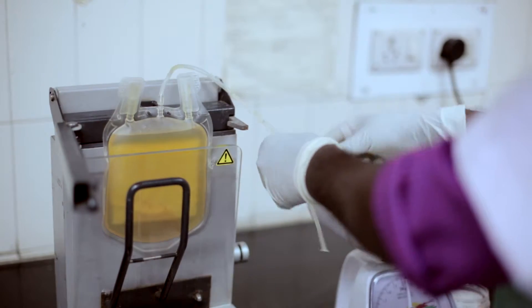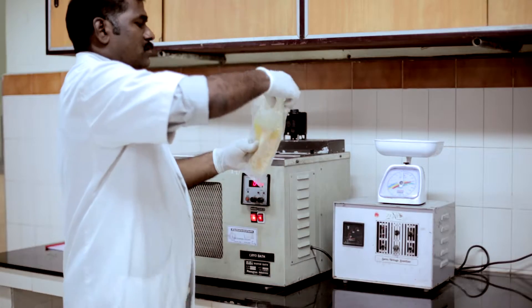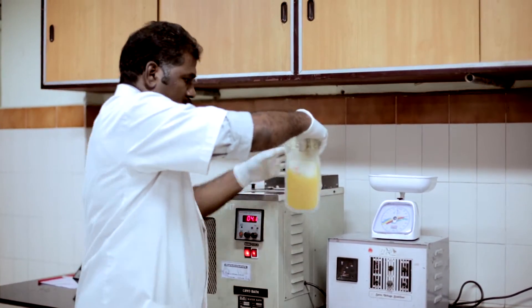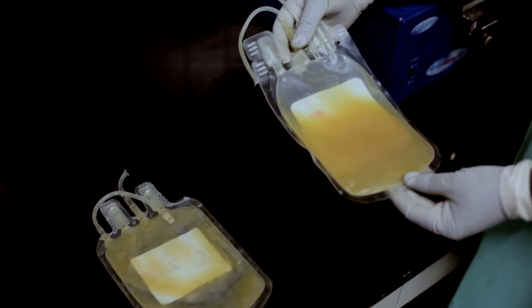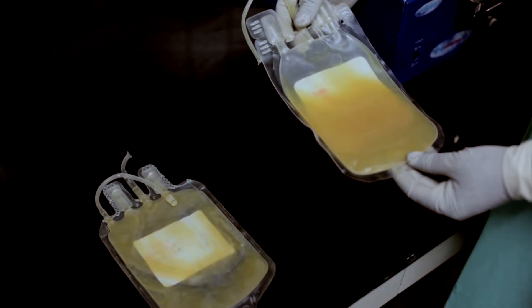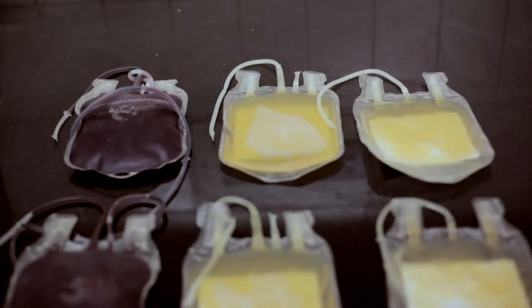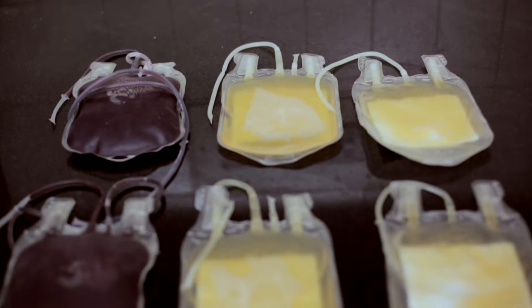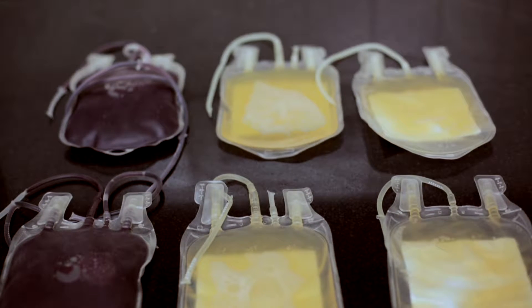Large volumes of whole blood were needed to achieve satisfactory replacement of a particular component. Significant advances in transfusion medicine have been made whereby separation of blood can be done in a closed system, and patients can be administered specific replacement therapy. One unit of donor's blood can be utilized for preparation of different components and thus can benefit more than one patient.